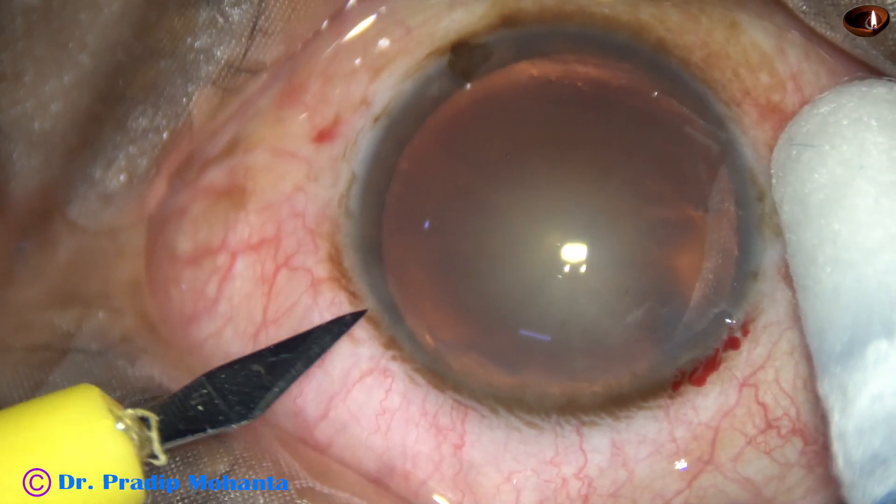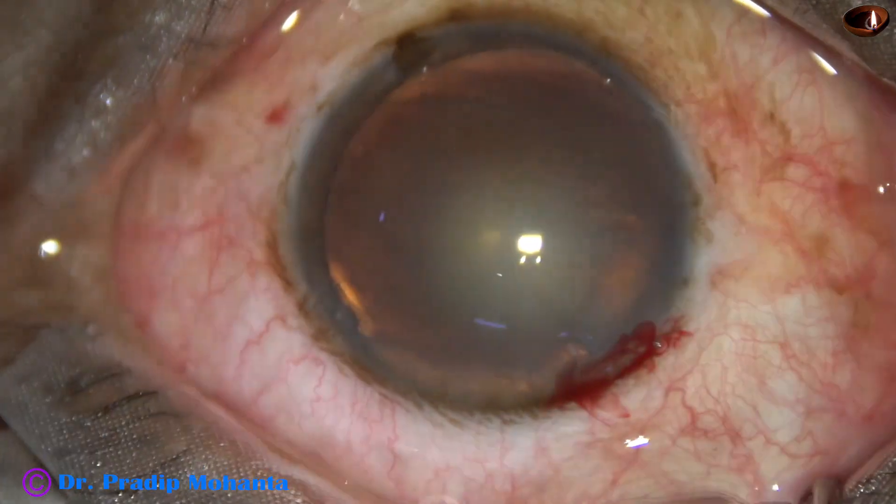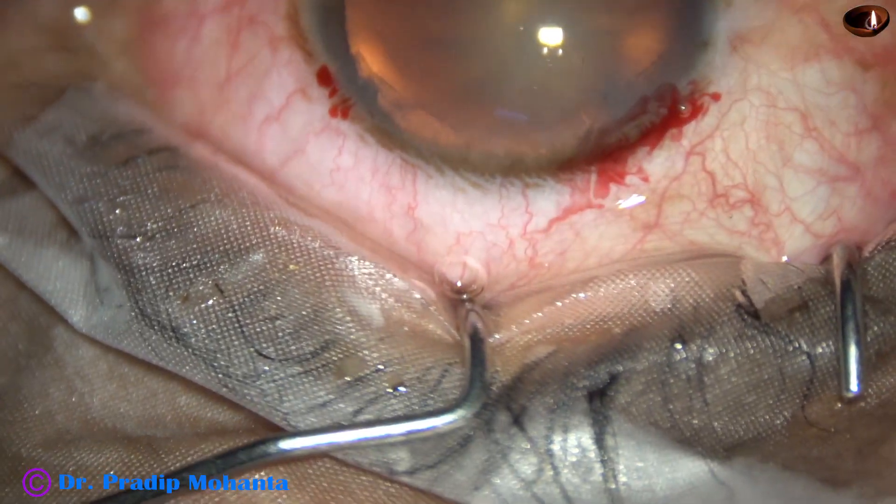Now a side port is made about 3 clock hours away from the main incision on the left side, and only one side port has been made in this case.